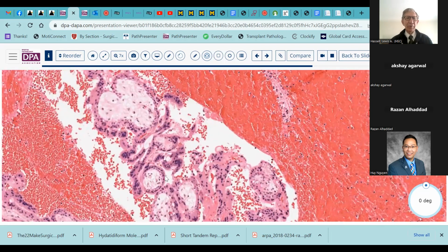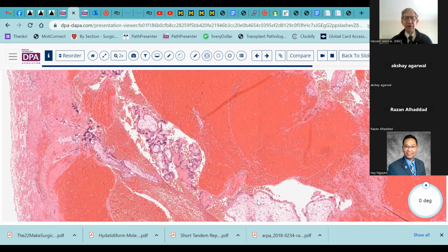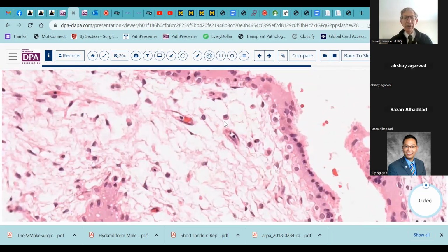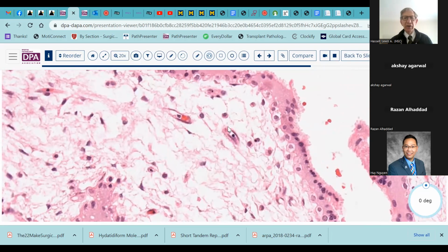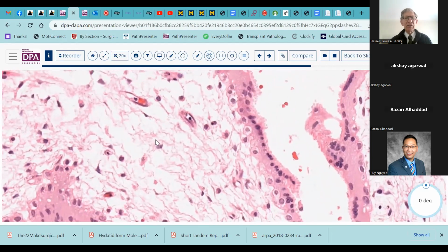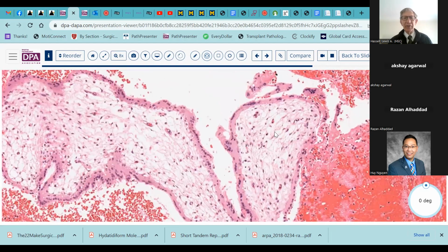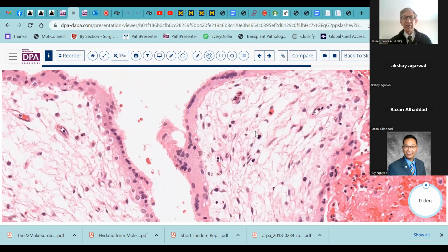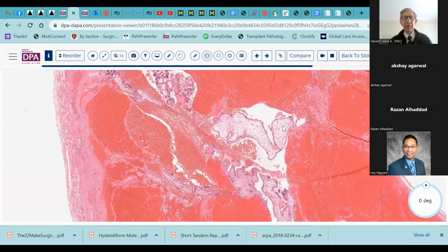They're viable, they're present with cytotrophoblasts, diffuse syncytial trophoblastic cells, as well as the villus architecture. We've even developed to the point where here you can see small vessels within these villi, which to me usually says that this isn't a mole. This is an embryo with a heart. It's got a vasculature, it's got a circulation that it's trying to develop.